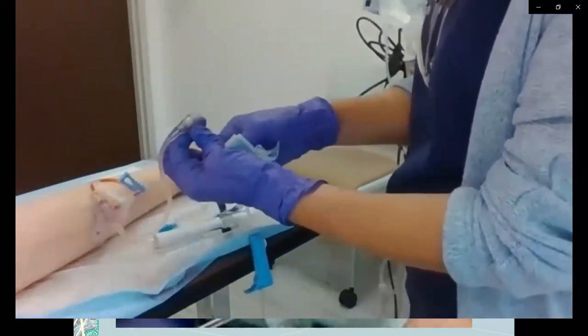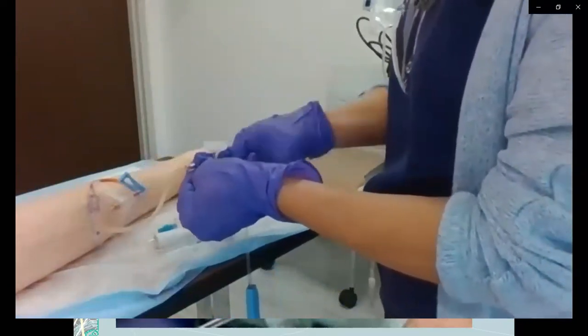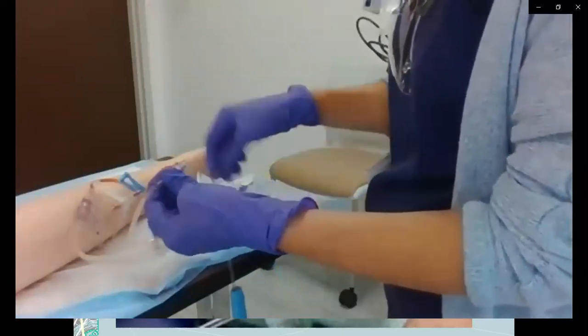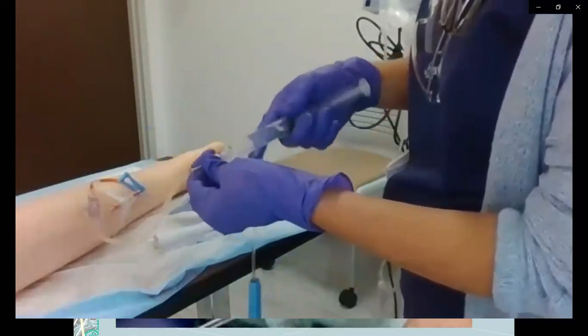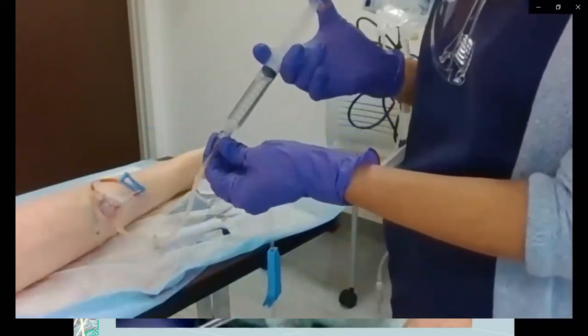Next up, so I've given the medication. I'm going to clean. And if this hub hasn't touched anything, if it's sterile, if it's clean, and you haven't touched anything, then it's staying clean. But just to be on the safe side, we'll clean it again, and then we'll flush again.